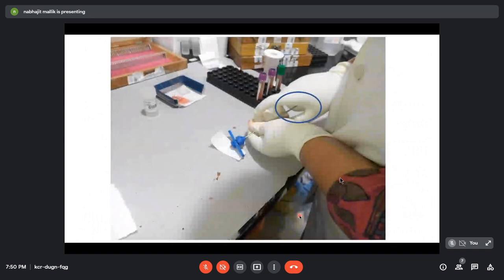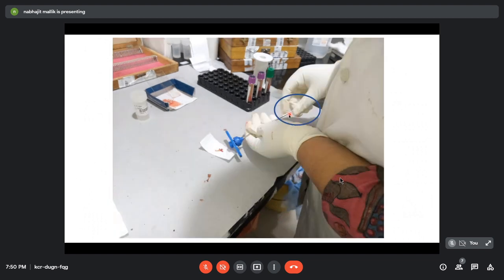Let me show this to you clearly so we can understand. So this is where we insert the stylet. We insert the stylet so that the bone marrow that was there is pushed through the hollow needle, and it comes out through this end, which is the mouth of the bone marrow biopsy needle, and here we are pushing it onto a clean tissue paper. Now you can see here it has been pushed and the bone marrow biopsy has been expunged from this hollow needle.